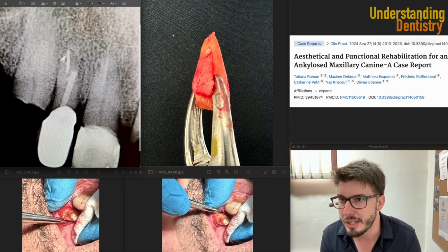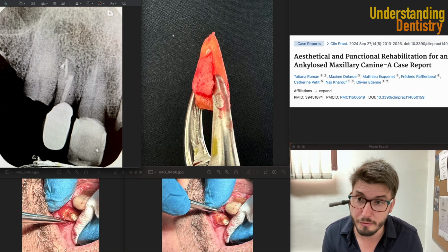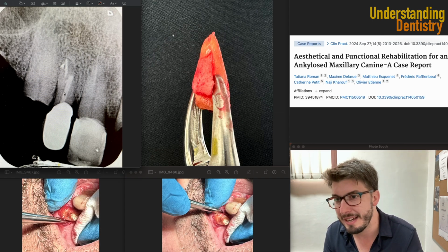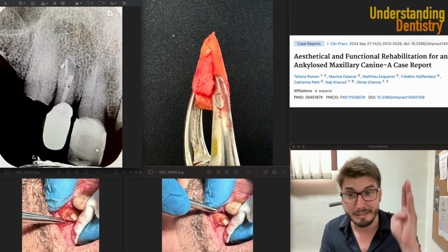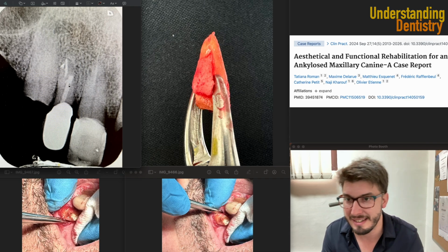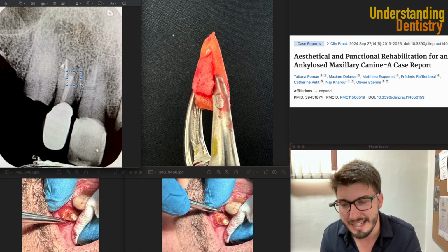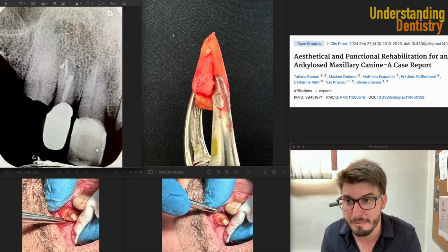And then let's just finish diagnosing this radiograph as usual. We have more alterations here. I hope you guys realized all of them. If not, pause the video and try by yourselves first. And of course we have this post, and the post should be following the root canal, but now of course there is a deviation, right? And now there's a deviation, and we don't have a lot of dentin thickness here, right? And that's actually something very bad for the prognosis of this tooth. Okay, so that's something very bad.